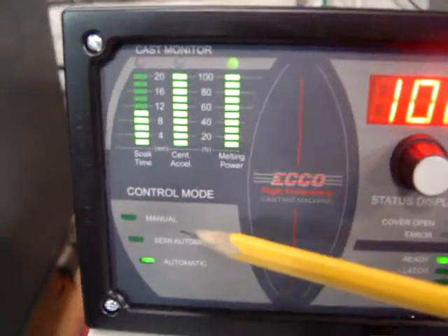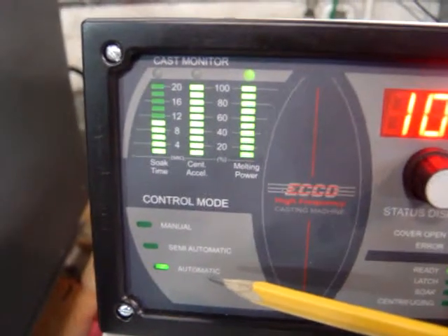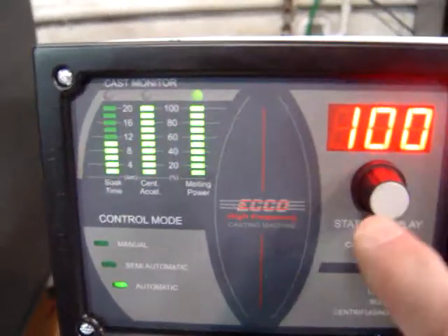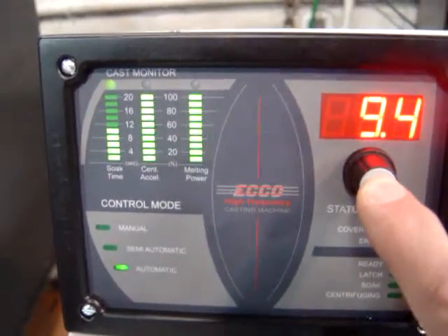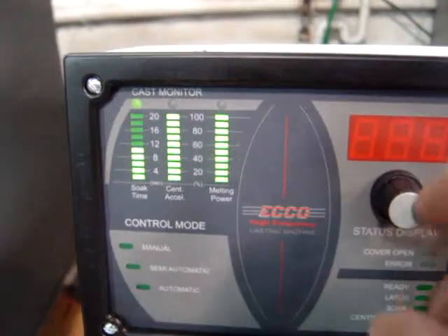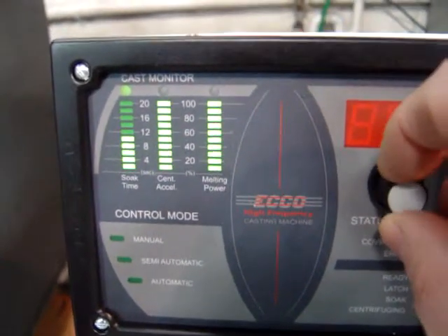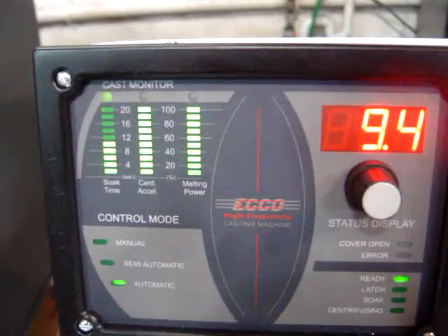Down here we have manual mode, semi-automatic mode, and fully automatic mode. These can be accessed by holding in the status display button until the parameters down here begin to blink. At that time you can adjust and select which parameter you want. In our case we're going to leave it at fully automatic and enter it in.